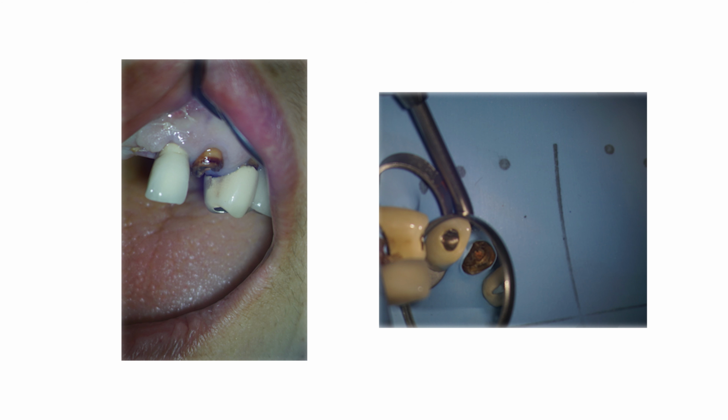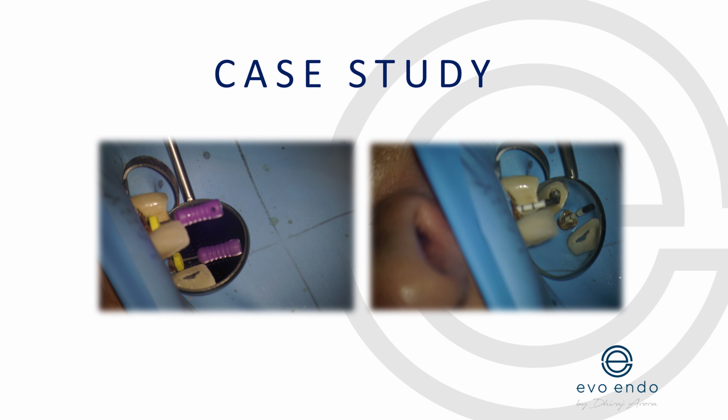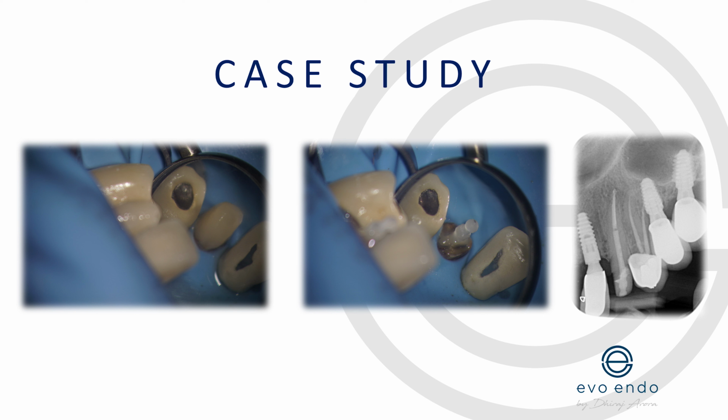And having a look at this pre-op image, you can clearly see that we did have that all the way around. If I've got a ferrule, I'm going to be placing a fiber post there, so I'm happy. Everything here is telling me this is predictable dentistry, which means I'm happy to proceed with re-RCT, post and core, and crown. Crown, luckily for me, is done by a prosthodontist.